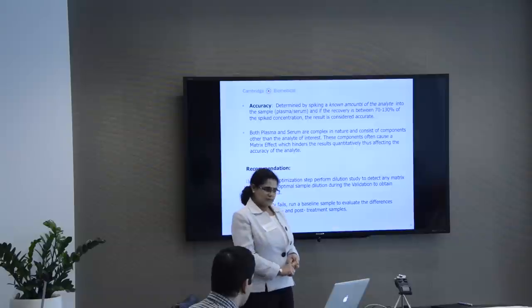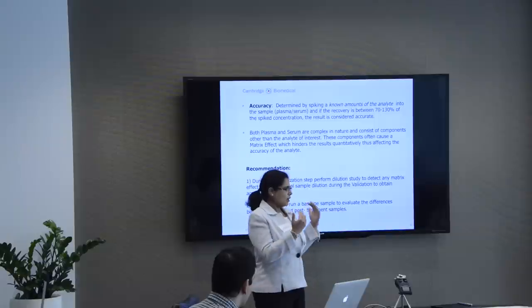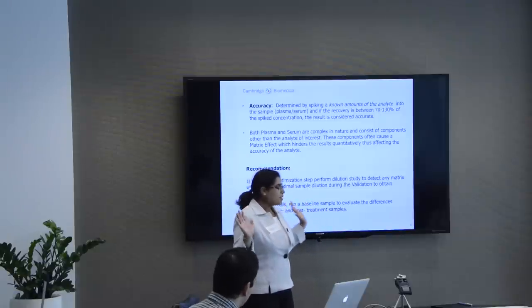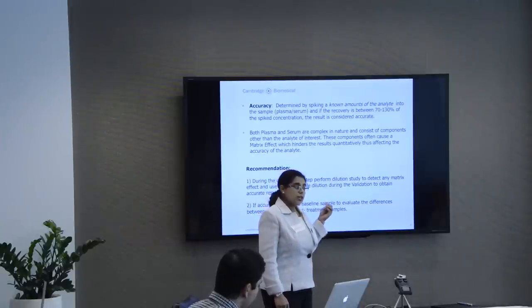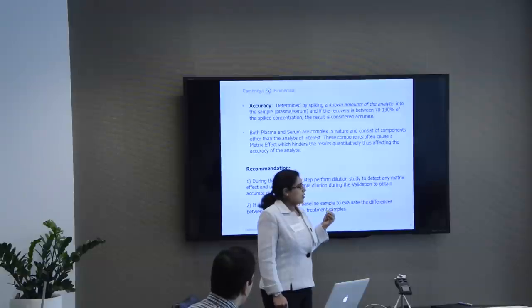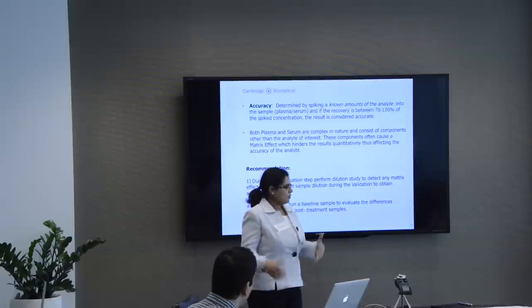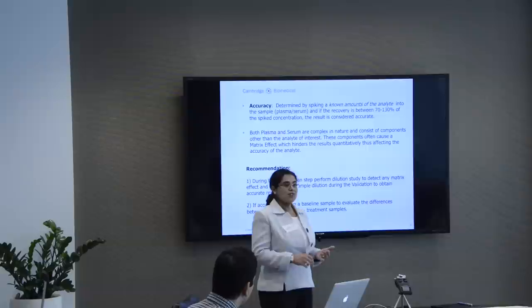Why not? Each kit, that's the whole thing. Each kit has multiple analytes. Either you take them individually, you validate individually, and you determine the dilution factor that's going to give you accurate results. Then you develop a kit for 5 cytokines, not 15. But it's the same plasma sample. Remember, we are multiplexing.